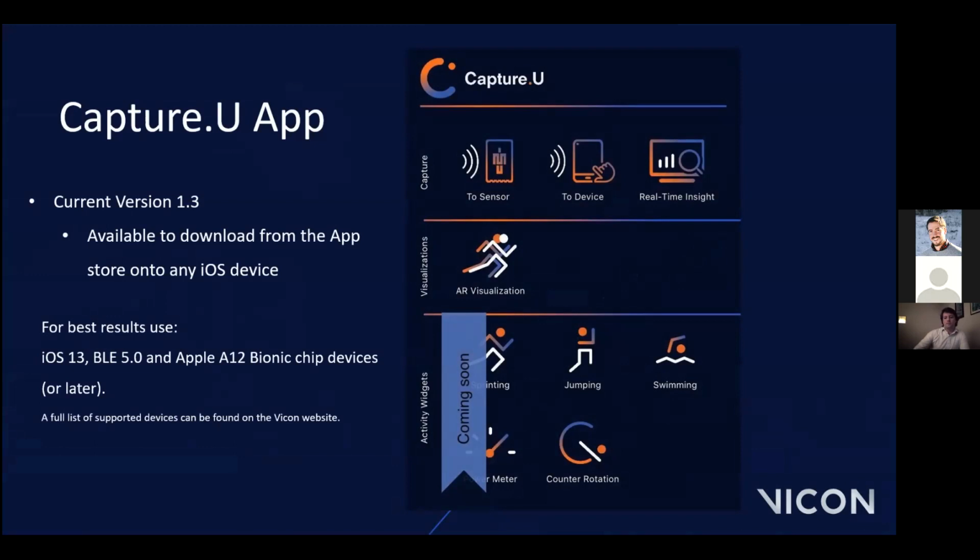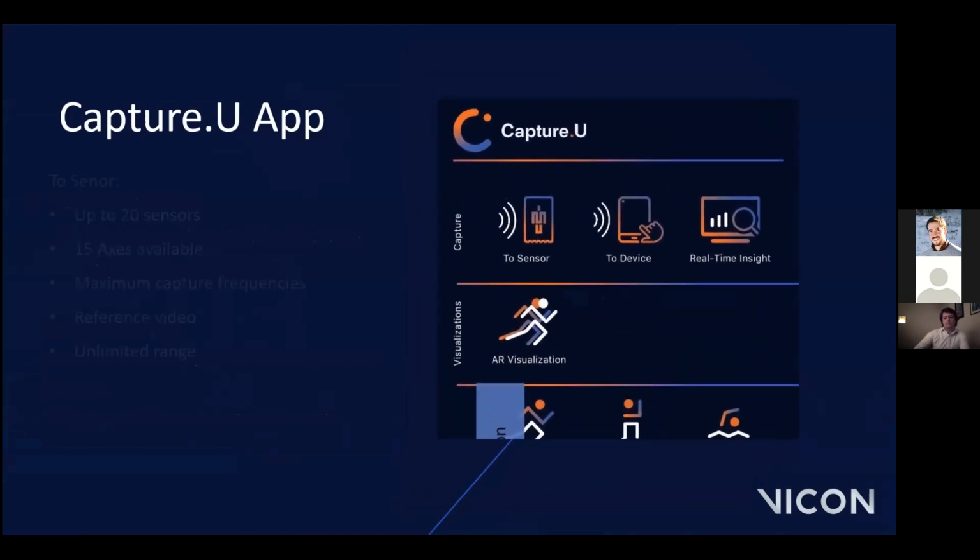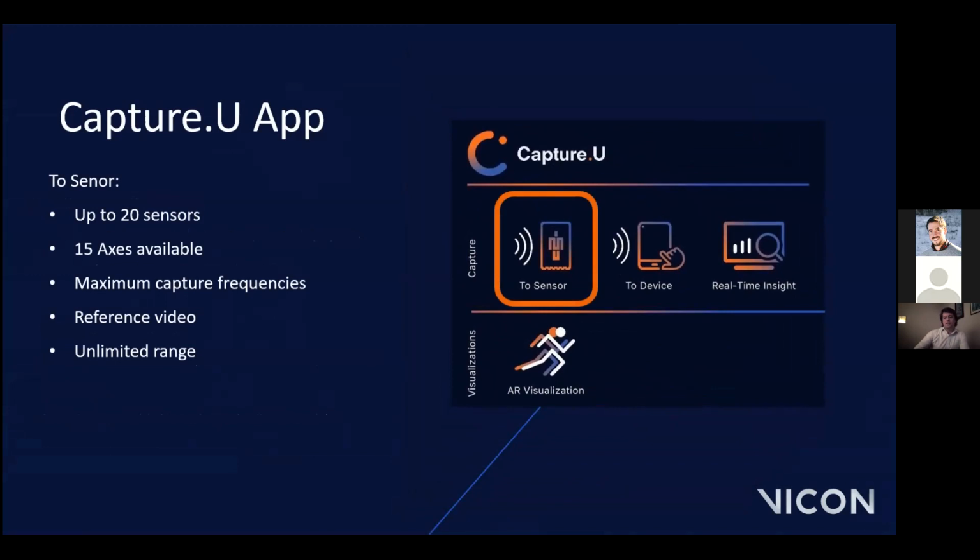There are 4 different capture methods that we can use. So firstly, capturing to the sensor. This will record data directly onto the individual sensors included in the trial. And using this mode, you can have up to 20 sensors with up to 15 axes of data, each component capturing at their maximum frame rate. For example, the high G sensor will capture at 1600 Hertz. You can include a reference video, and the sensors have an unlimited range, meaning you are not restricted to the Bluetooth connection.